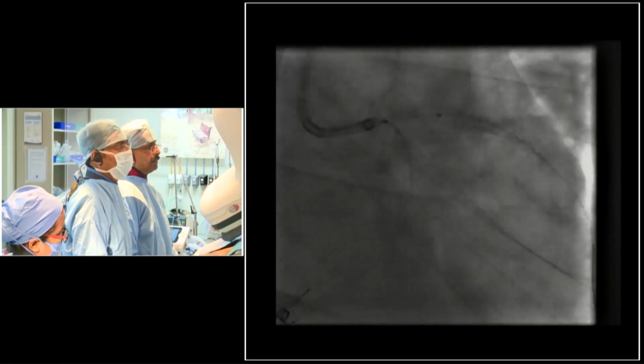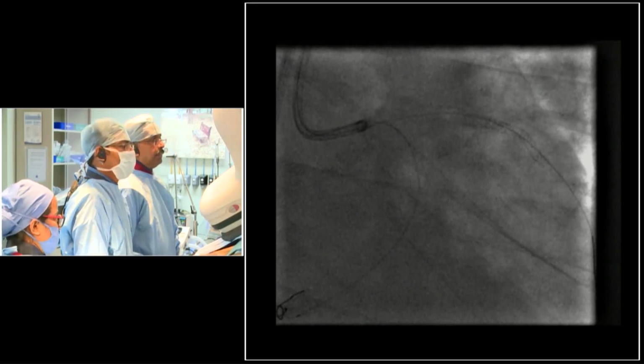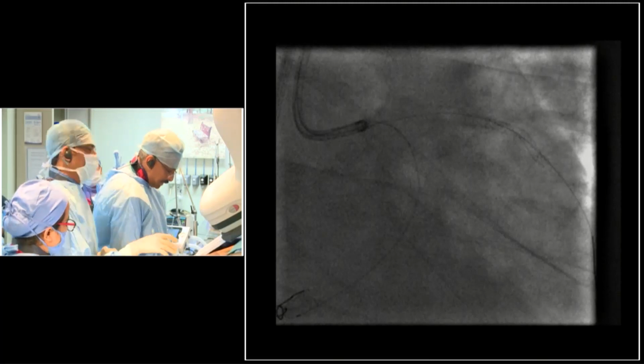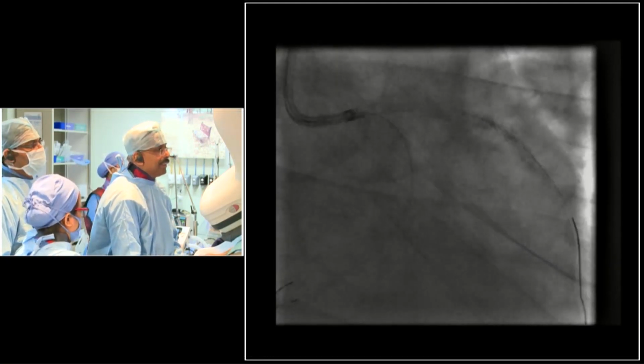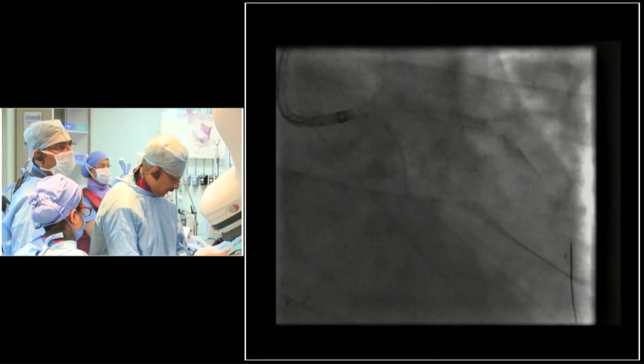We are not able to appreciate the balloon dilatation fully. It's a little difficult in this lab. Unfortunately, the lab has a little problem of ours. I'm sorry about that. But anyway, I can see it, and mark my word, it has come up better. And we'll show you some IVUS to be sure that what we've done is okay.